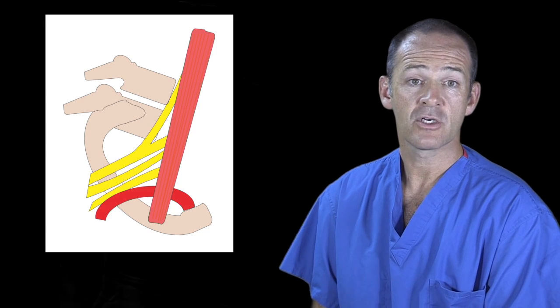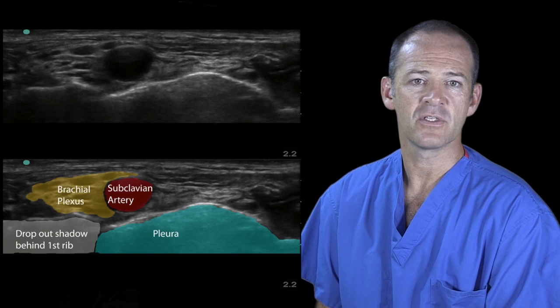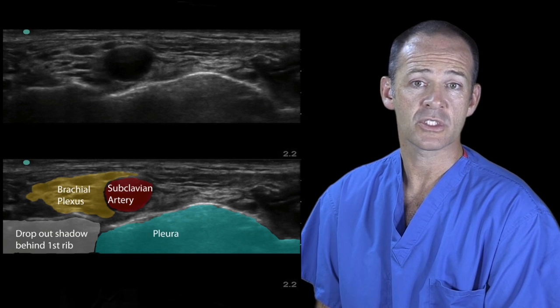The first rib curves around the dome of the pleura. This curvature makes it difficult to visualize more than one section of the rib at a time when scanning. The pleura lies medial to the rib, so rigorous needle visualization is essential at all times during the performance of this nerve block.